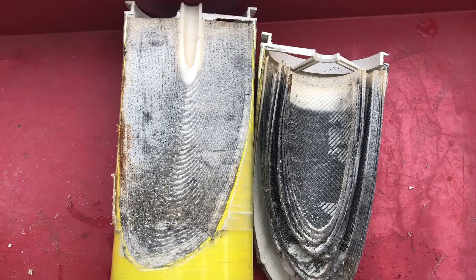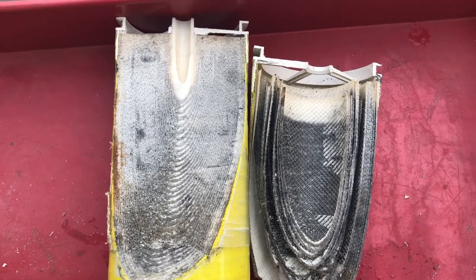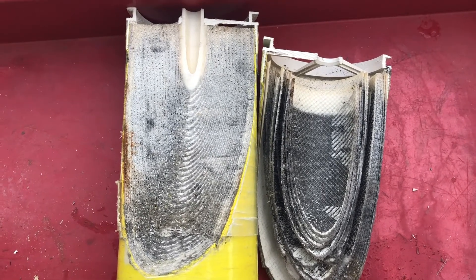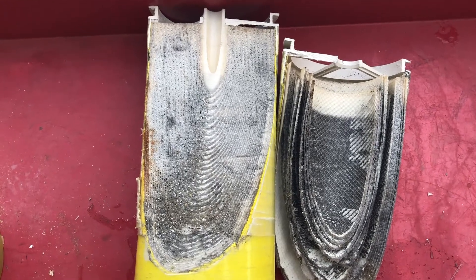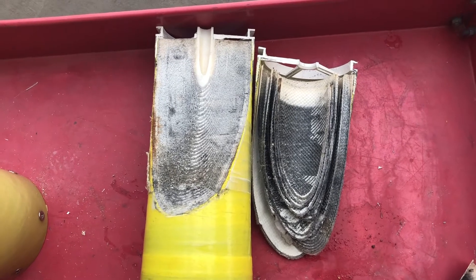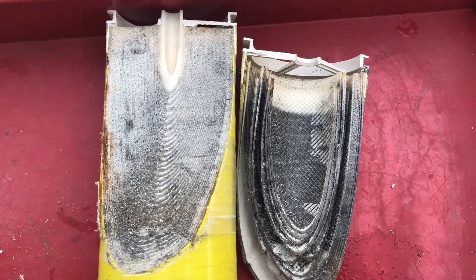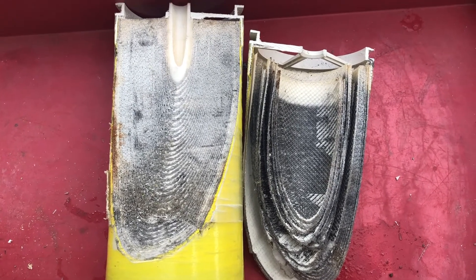I recently had to change the membrane out of a WRO 300. It's a small RO unit sold by Markor Purification for dialysis — a single membrane reverse osmosis system. We had to change it because the membrane wasn't performing very well.